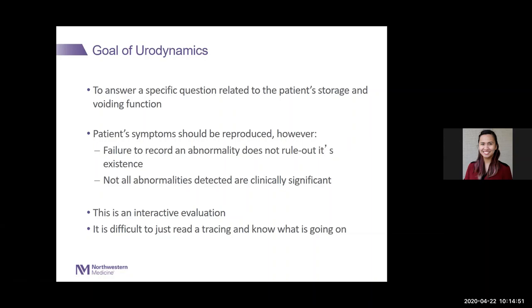However, if you think about it, when you do urodynamics, you have a patient sitting with catheters in them, they're sitting on a little stage, there's at least one other person in the room, typically, oftentimes two. Sometimes there's x-ray involved. And so it may be hard for the patients to reproduce their symptoms. And certainly, it's hard for people to pee in that situation. I can't tell you how many referrals I've gotten for retention of urine for patients that really don't have retention, that they just couldn't pee during the urodynamics study, which I think is more normal than abnormal, honestly. It is an interactive evaluation.